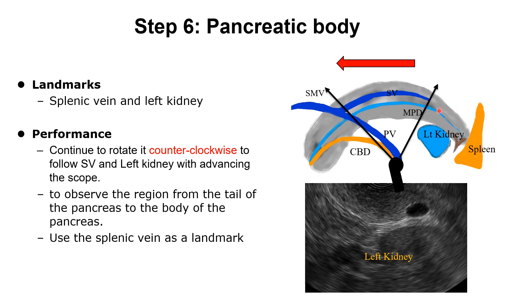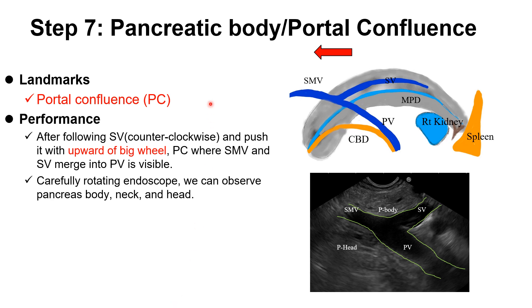Step 6: Pancreatic body. Continue to rotate the endoscope counterclockwise, following the splenic vein. Step 7: Advancing with the scope from pancreatic tail to pancreatic body. Pancreatic body and portal confluence — a good landmark here is the portal confluence. After following the splenic vein with counterclockwise rotation and slight scope torque, we can see the portal confluence on EUS imaging — SMV and splenic vein merging into the portal vein. Carefully rotating the scope, we can observe the pancreatic body, neck, and head area. The portal confluence is a very important landmark in these steps.